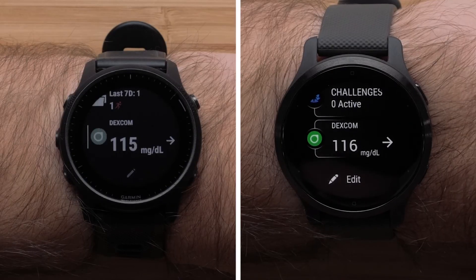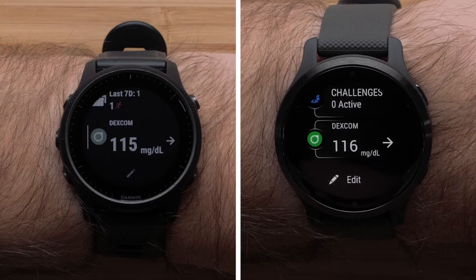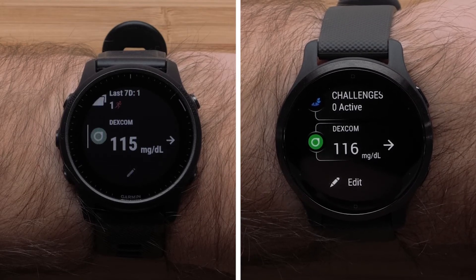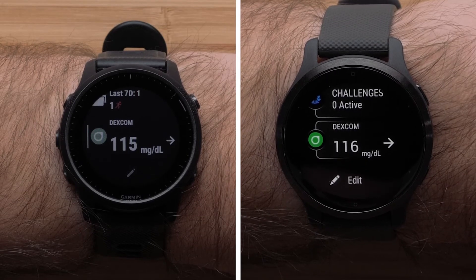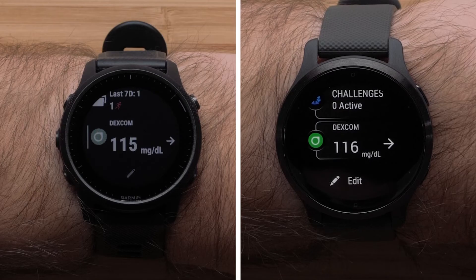Once signed in, you can return to your watch and the sign-in will be complete. You will now see your glucose levels displaying on your watch.